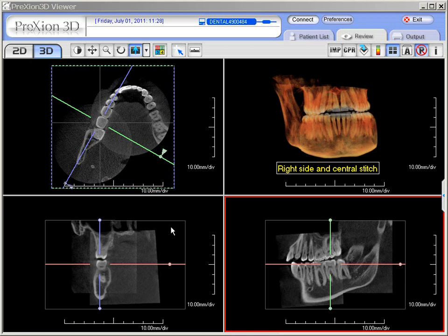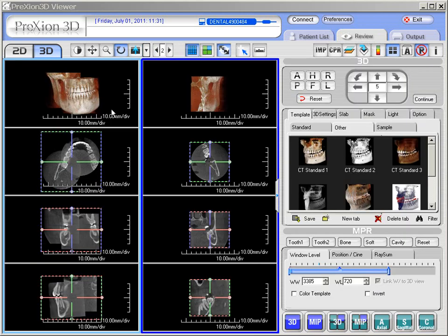For the left stitch, we take the right and central stitch that we just completed, add it to the multi-data list, then go up to the left side, click it, take the 512 slices, add it to the multi-data list, and load up those two data sets together. Here is our right and central stitch data set, and this is going to be our left side of the patient that was scanned.